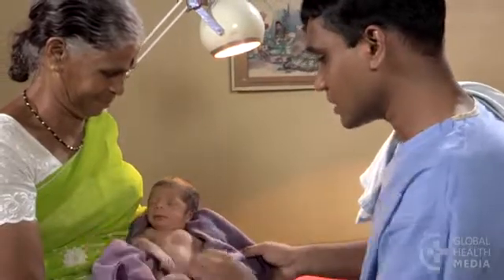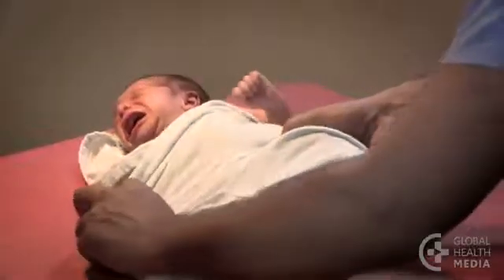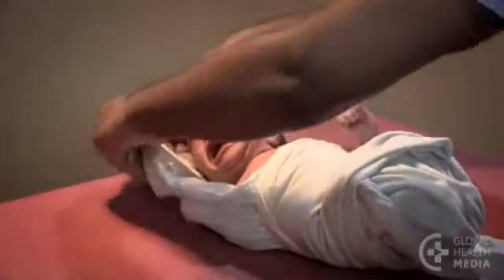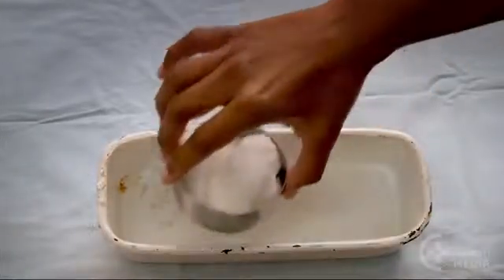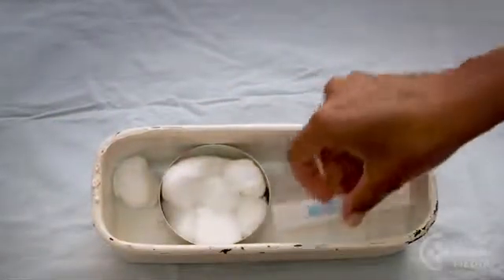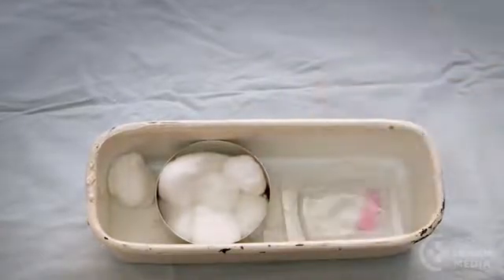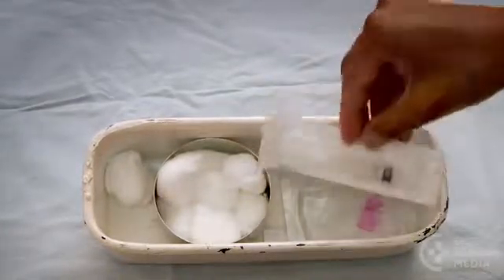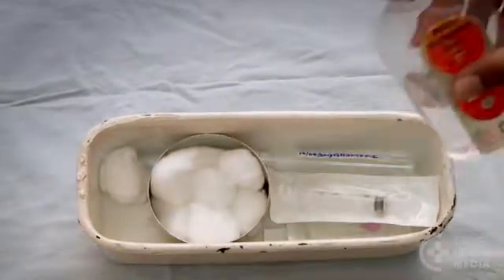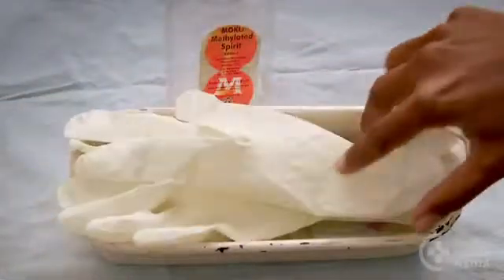First, let the caregiver know about the procedure, then wrap the baby snugly. Now, gather your supplies. Cotton balls, either a needle, 21 to 23 gauge, a butterfly, 23 to 25 gauge, or a syringe and needle. Add a labeled blood tube, pour antiseptic on the cotton, and remember your gloves.